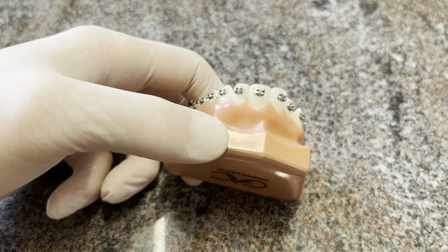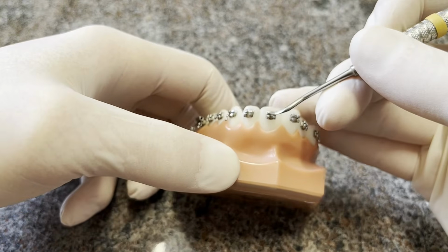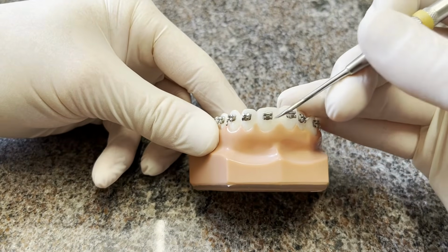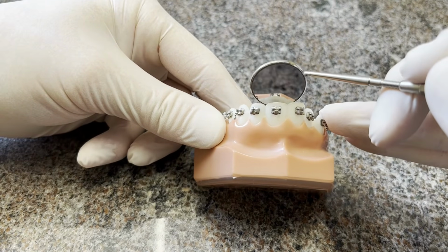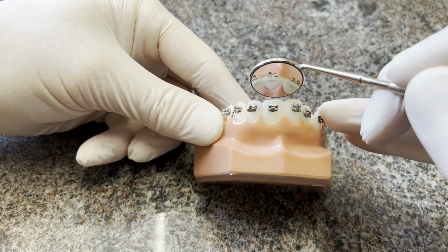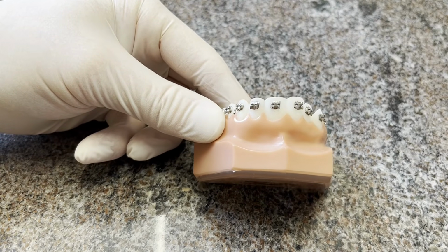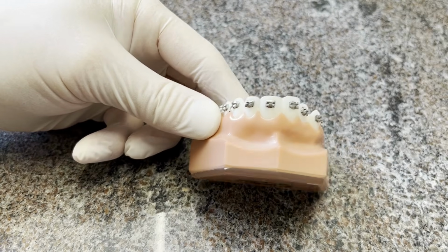And then you move on to the 1s, position it, eyeball it, so you're getting it about where you want it to be, seated into place, clean up your flash, look from the incisal edge to make sure that that slot is parallel to the incisal edge of the tooth. And then you look with your eyes to make sure that it's parallel to the long axis of the tooth.